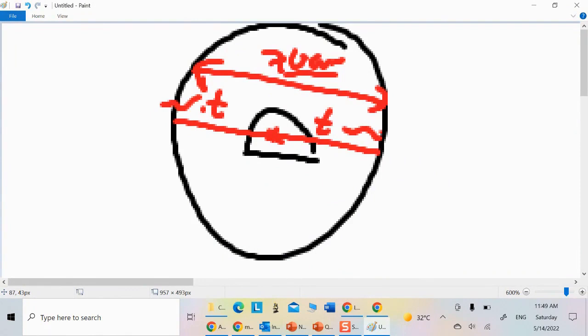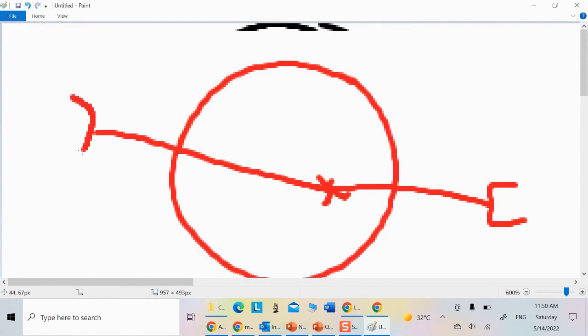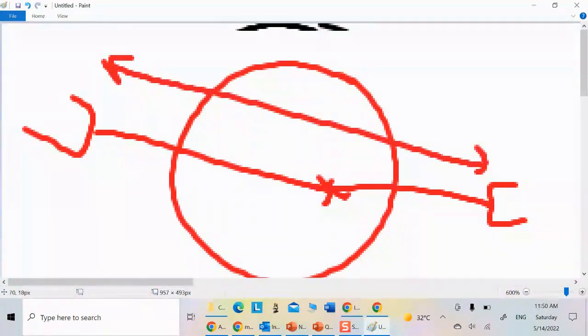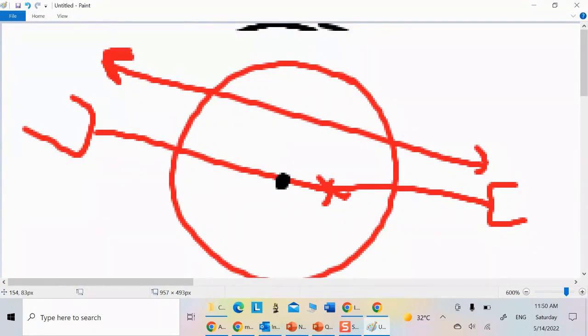Now, if the location of the annihilation is not in the center, here, for example, at this end, let's say that the detection device indicates that this midpoint area is exactly that. But there is a difference between the midpoint area and the area where the actual annihilation is. From the midpoint area to the location of this crystal, I will call it R.